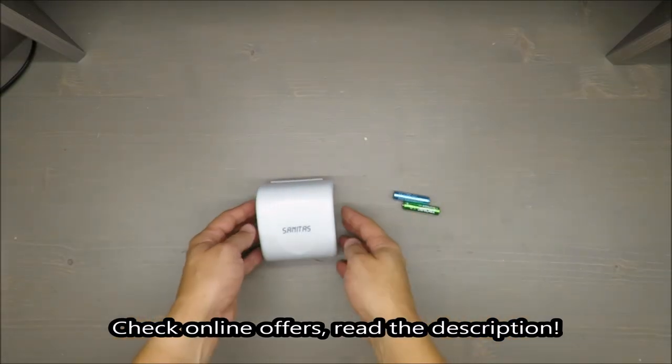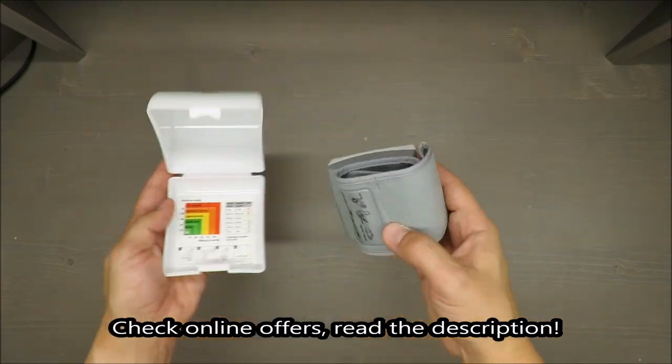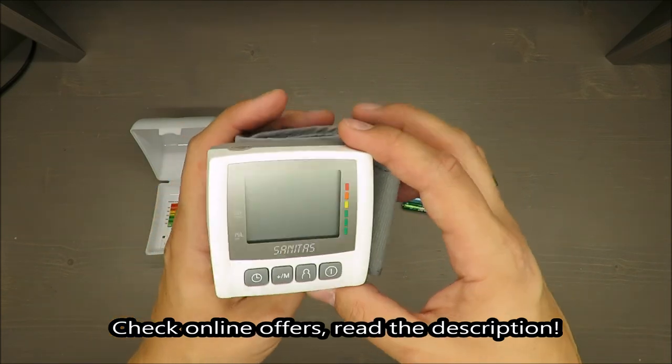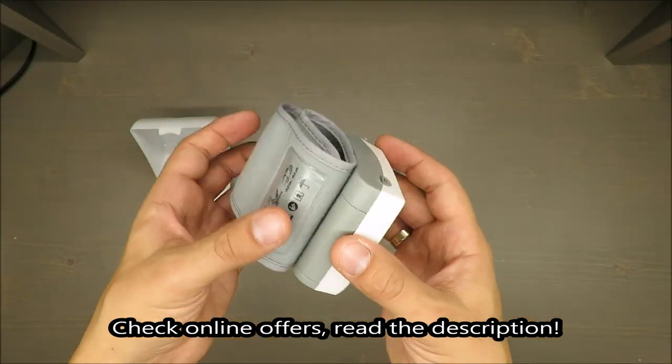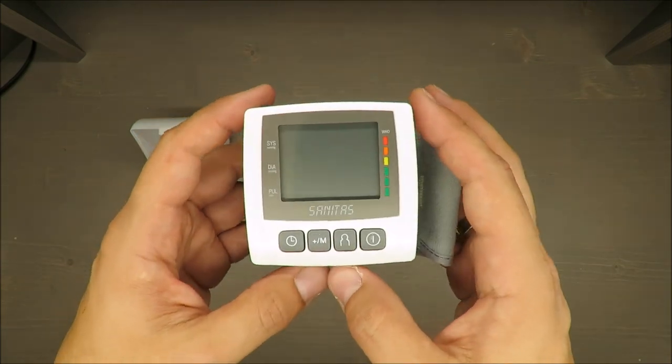Hello everybody, this is Out of the Box Unboxing, and in today's episode I'm going to review for you this tension meter from Sanitas. As always, at the beginning, some basic features. I think one of the best features is the three-year warranty.